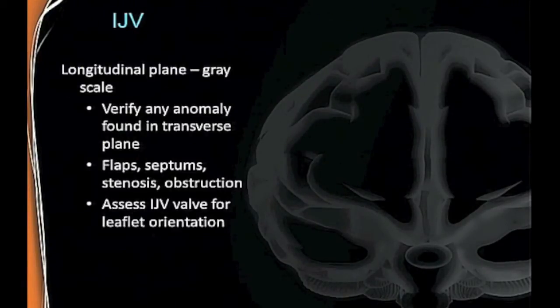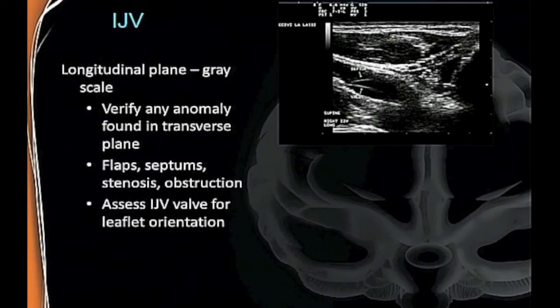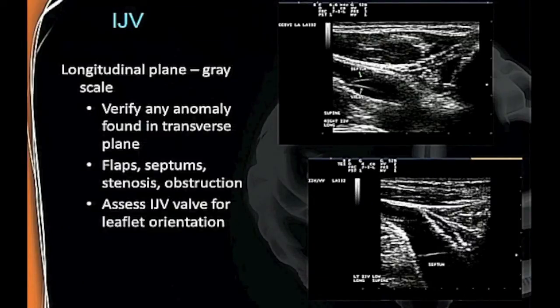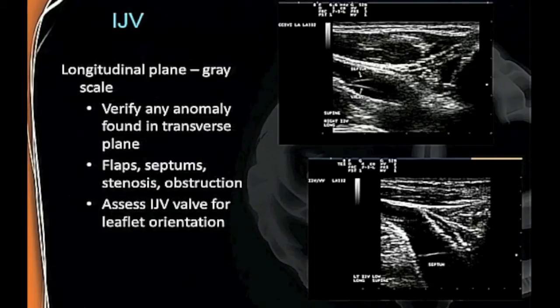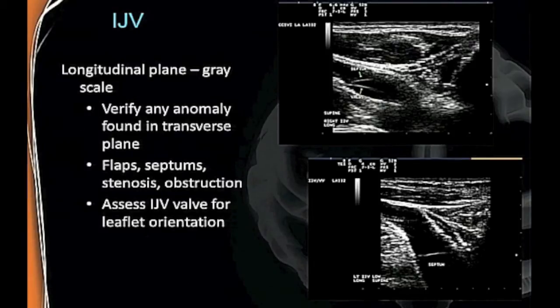Now in longitudinal grayscale, here you can see the valve coming down and a septum going right across. You'll need to verify anything you see in grayscale in both transverse and longitudinal—it's just a verification step. Here's another septum going right across, actually below the valve. This is still important because the jugular also functions as a reservoir—it normally dilates open when blood flow increases, waxes and wanes. But with a septum across it, it can't open fully. It's like holding it there, restricting the flow.